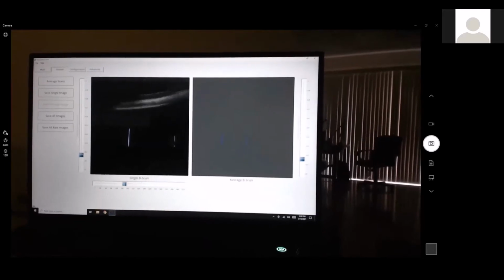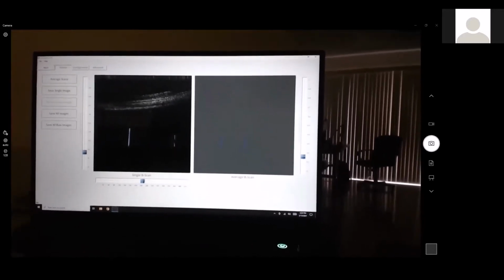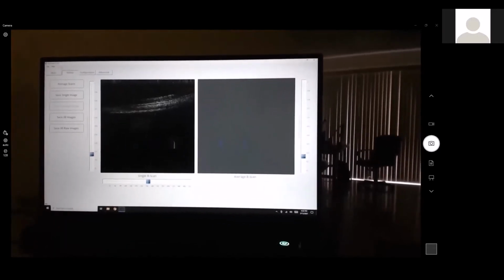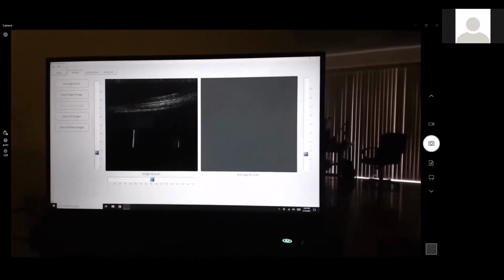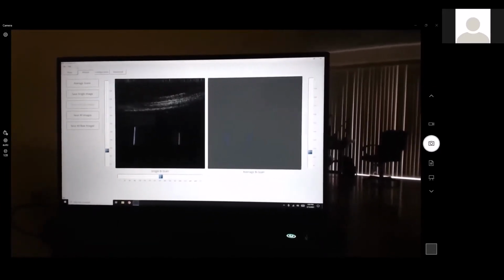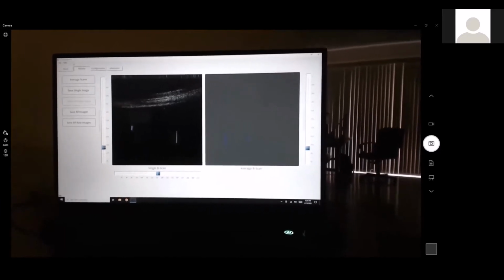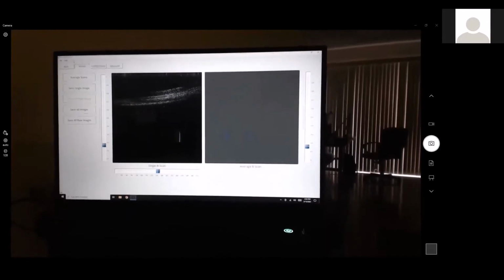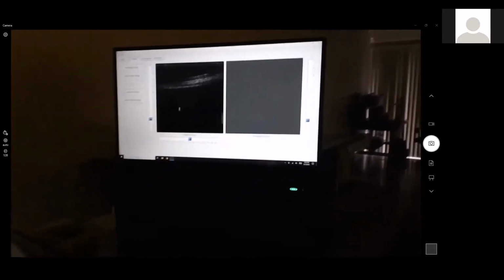I guess what we want to highlight from doing the rabbit sedated was basically how we're positioning the animal, how we're using whatever system you want to have the optics align very nicely and make it easy to see into the eye. We want to make sure that the platform and the animal and everything is very, very stable as we've managed to do here. And then, of course, you want to be able to do your scans both for the 2Ds and the 3Ds and review your data and make sure that everything is as you expect it to be.